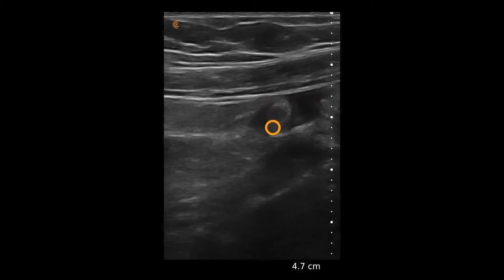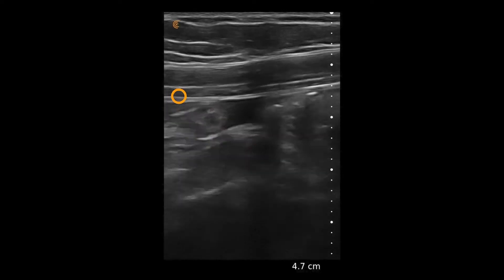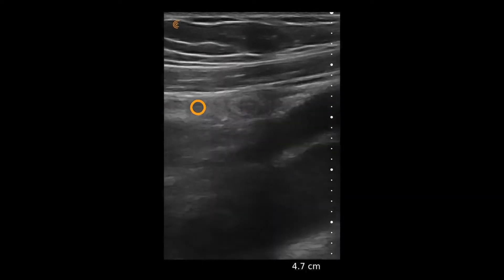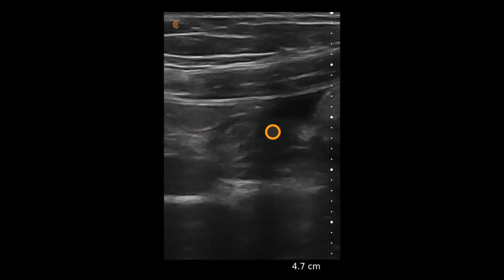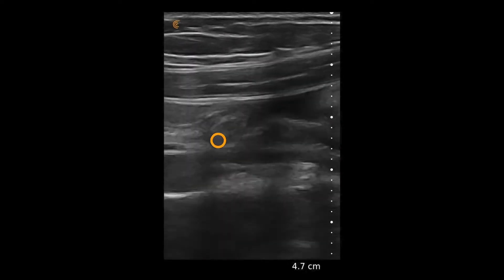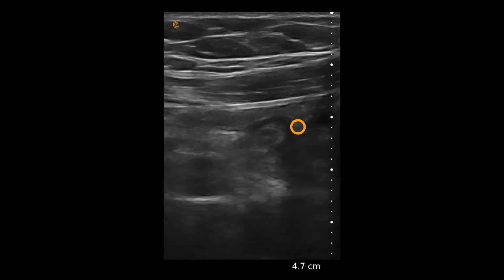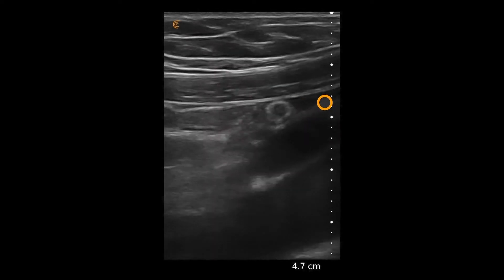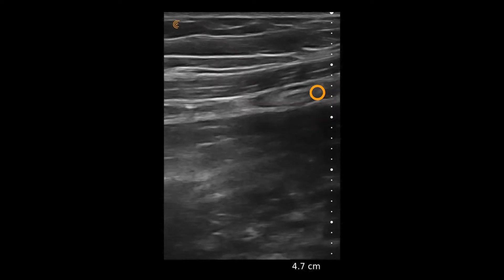Here's the peritoneum, and here is a tubular structure that is non-compressible as the scanner is providing and applying pressure, scanning down the length to see what this object is. It's not compressing with pressure, and surrounding it is some free fluid that is visualizable here as anechoic material.